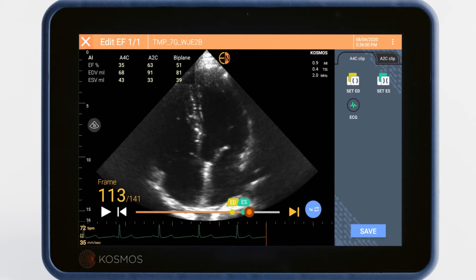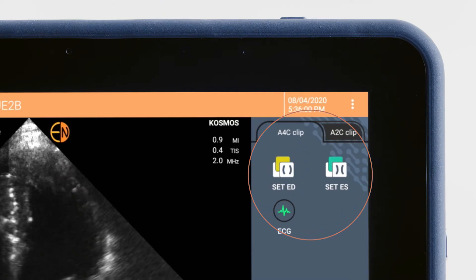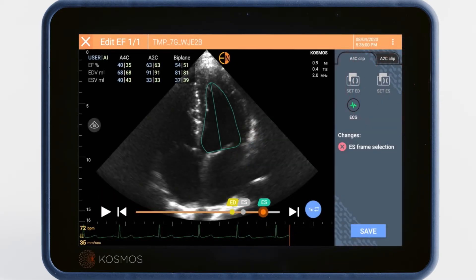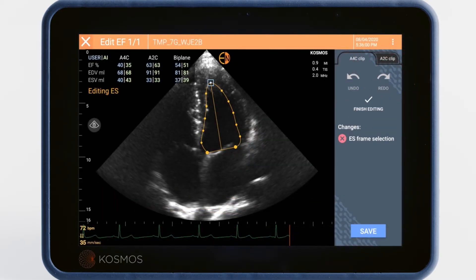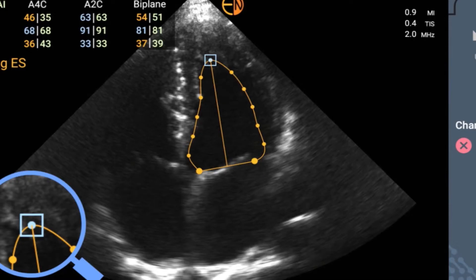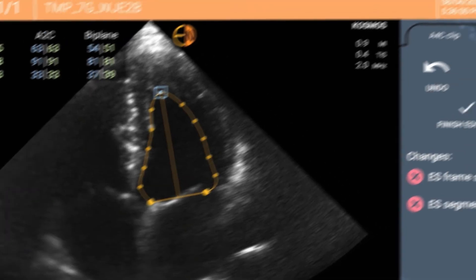You can tap on the icons in the top right menu to set new systolic and diastolic frames. When you select a new systolic or diastolic frame, the AI will retrace the left ventricle, which you can then adjust by simply tapping and dragging any dot in the outline. The three larger dots denote the base and apex of the ventricle.